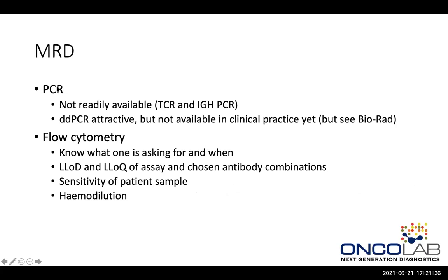All right, then just quickly for MRD. The quantitative PCR and allele specific PCR are not readily available in South Africa. We do have this qualitative T cell receptor and IGH PCR, which, as I've mentioned before, often confuses people. Droplet digital PCR is very attractive, but it's not available in clinical practice yet, as far as I know. I'll show you now, we evaluated an instrument by Biorad, and it is extremely attractive. And then flow cytometry, I'll get back to.